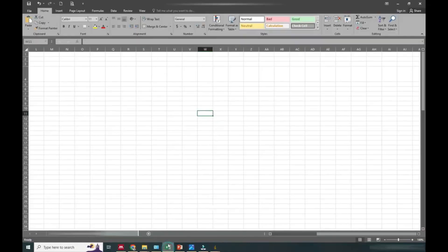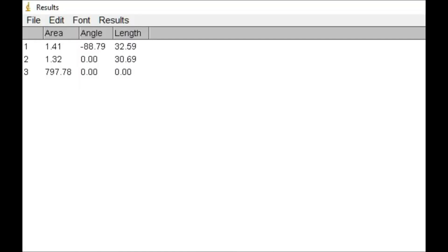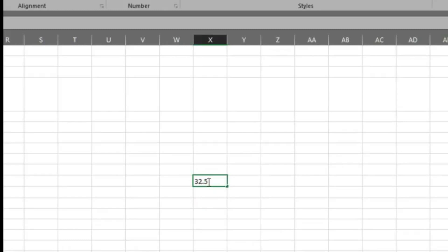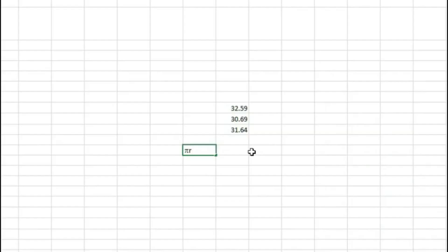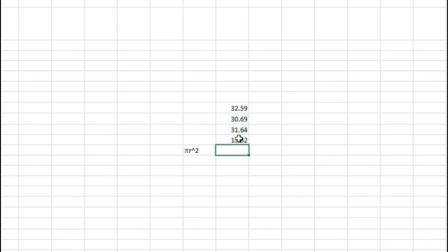Going to Analysis, we can see the result is showing approximately 797.78 area — though it has taken some extra part as well. So accordingly we have to calculate the approximate area. We have two readings for length and width taken earlier, and we will take the average of those, which comes to around 31.64. We will then apply the formula π r² for the area of a circle, calculating the radius as diameter divided by 2, giving us 15.82.